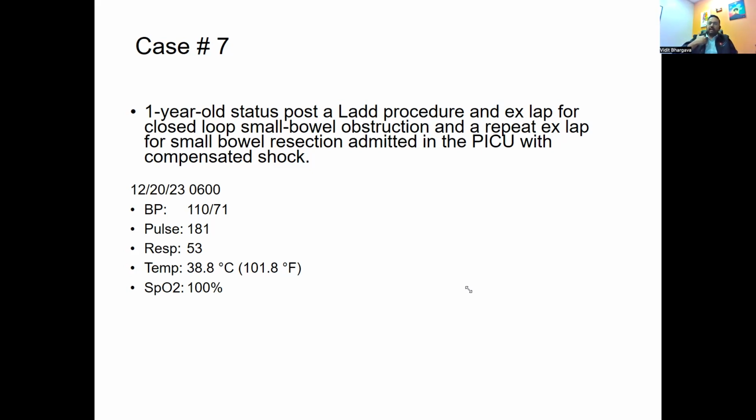As you slide from an area that has no sliding to an area where you see lung point, that in my mind would indicate the boundary of the pneumothorax, at least on one side, and then you can do it for multiple different areas. So you get a sense of how big the pneumothorax is and where it is. But in terms of depth, that is something you would not be able to gauge with that.